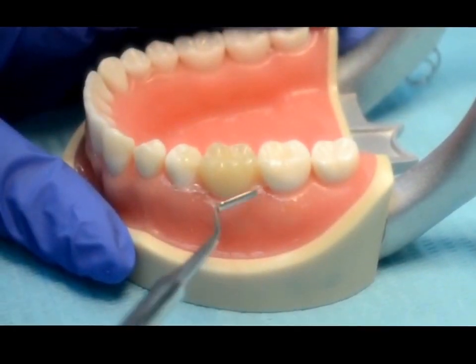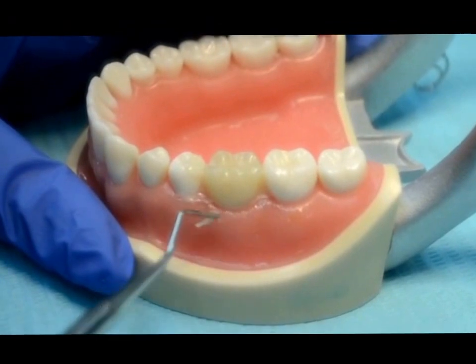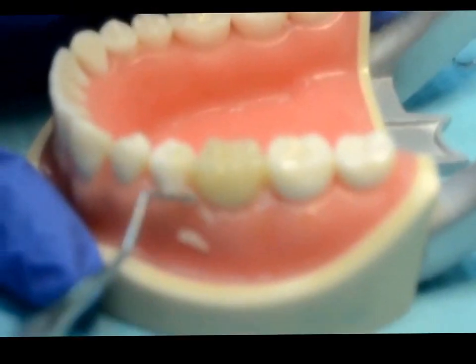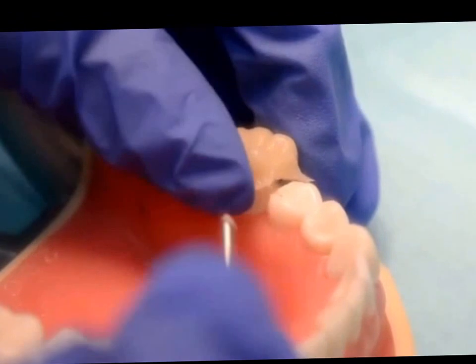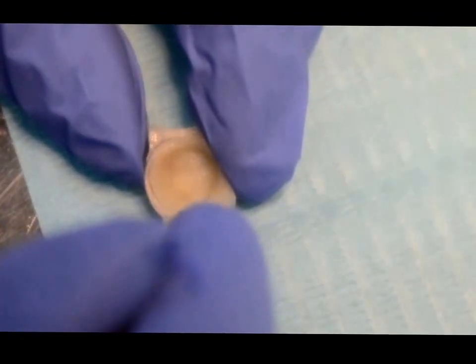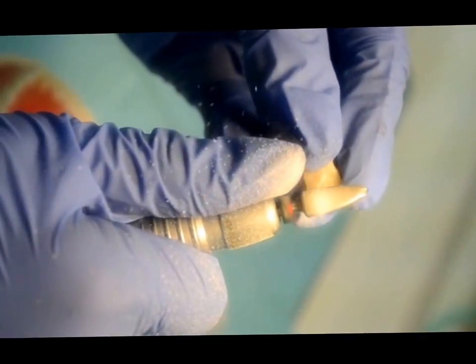Using plastic instruments, you have to remove the excess material. You have to mark the finish line using a pencil.